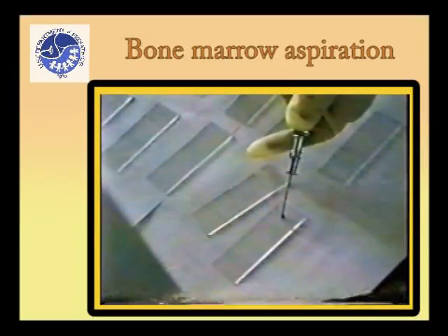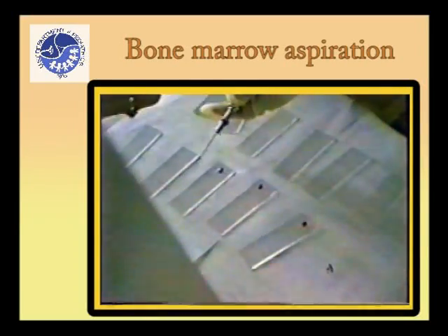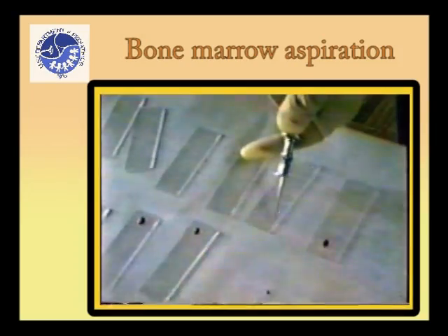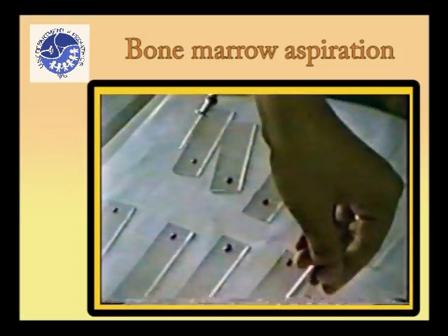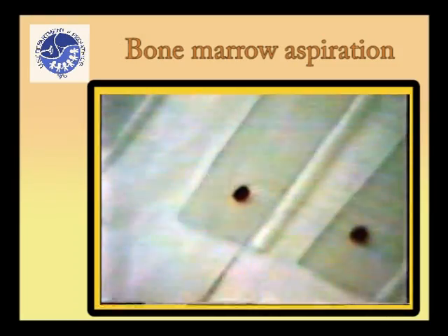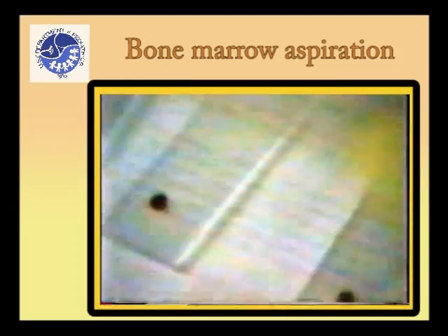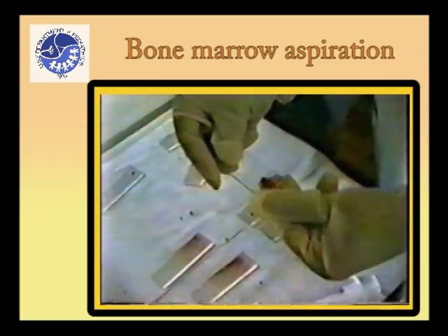Discharge a small drop of the aspirated marrow onto one end of each glass slide. Tilt the glass slide to allow excess peripheral blood to drip and concentrate the bone marrow spicules on the surface of the glass slides prior to spreading. The presence of white clumps of salt-like material on the glass slides represents bone marrow spicules and is indicative of adequate and appropriate specimen collection.